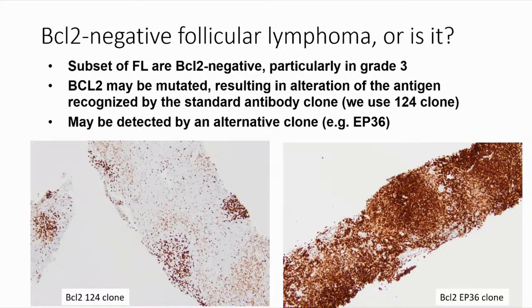And molecular studies, if you still feel like you can't be sure what you're dealing with, can be reassuring that this is polyclonal. The other thing is you can see a more mixed infiltrate, and those ones I'll often stain for Epstein-Barr virus, looking at CD30 and EBV. Do we have a mucocutaneous ulcer situation going on? Other times there could be some sort of infectious organism that's resulting in a more robust inflammatory infiltrate.